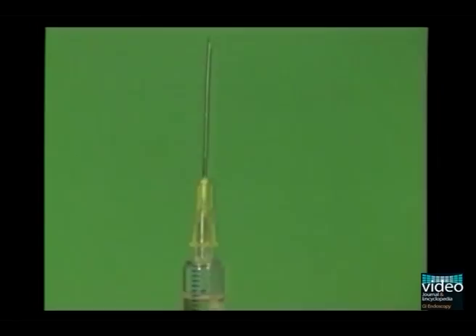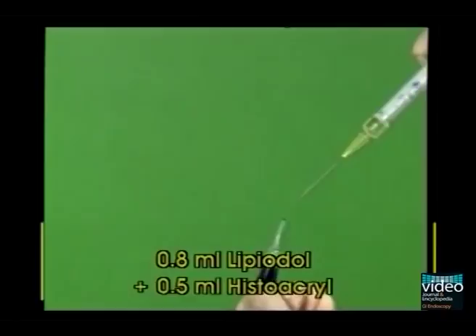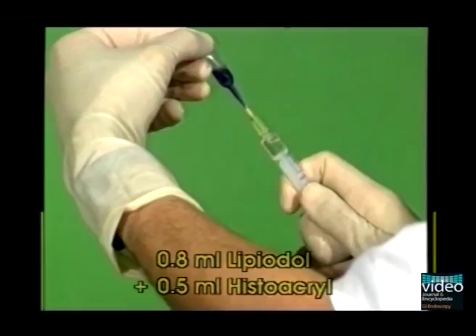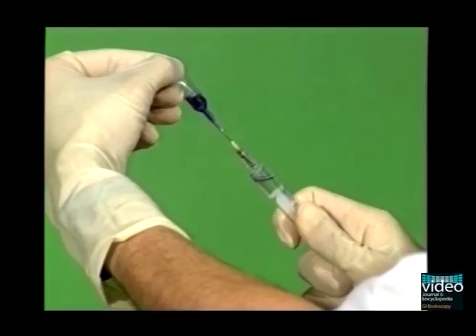To prevent the cyanoacrylate from solidifying too quickly, dilution with lipiodol is necessary. The optimal mixture of cyanoacrylate and lipiodol is essential to achieve optimal results and avoid complications. We recommend the following proportion: mix 0.8 milliliters of lipiodol with 0.5 milliliters of cyanoacrylate.